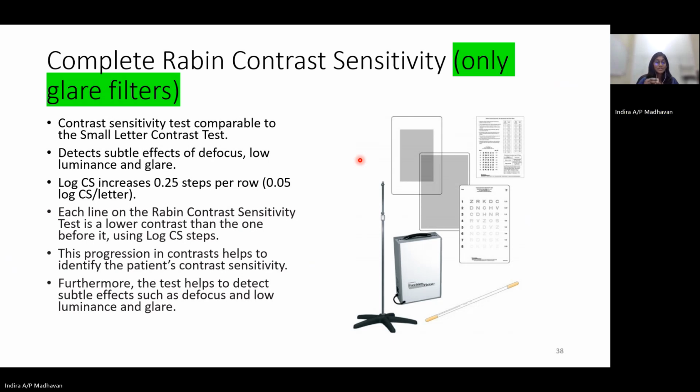So these patients will benefit from additional lighting or devices with built-in illumination, like an illuminated stand magnifier or illuminated handheld magnifier. Any magnifier or glasses provided to them will help them see better with the help of additional lighting.